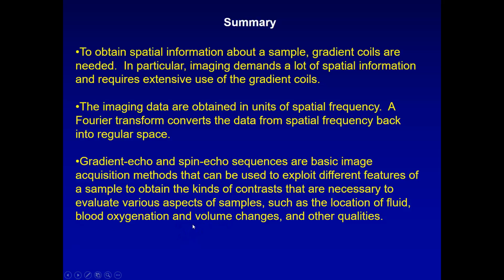Has the brain decreased in volume in response to Alzheimer's disease? We can answer these questions using MR imaging. That concludes the lecture on basics of MR imaging.